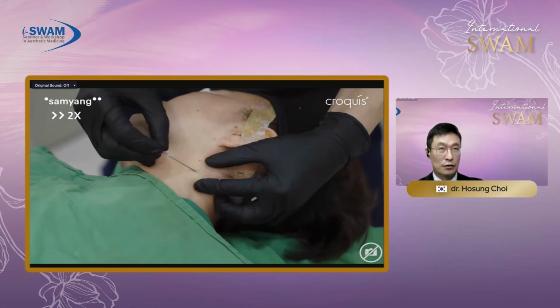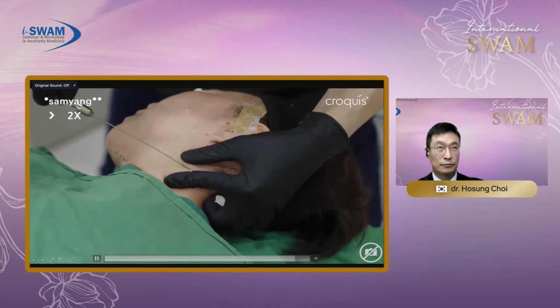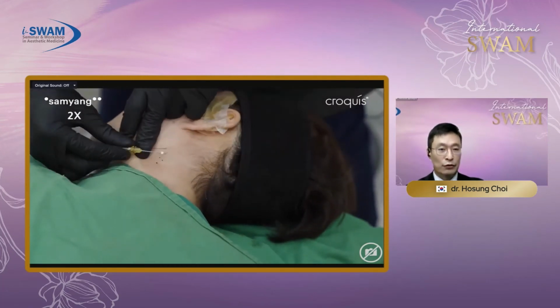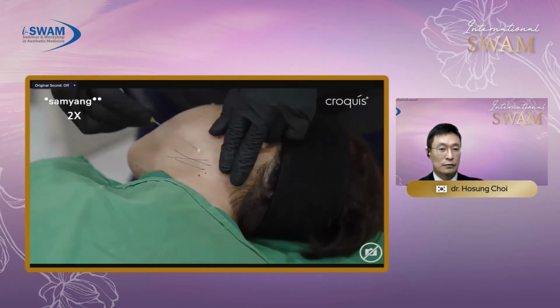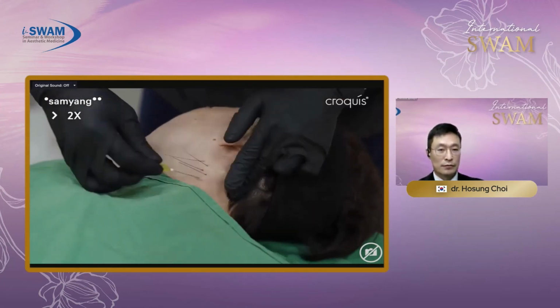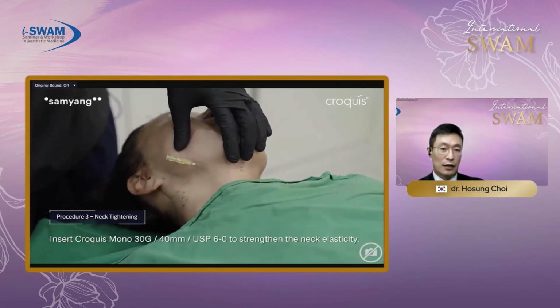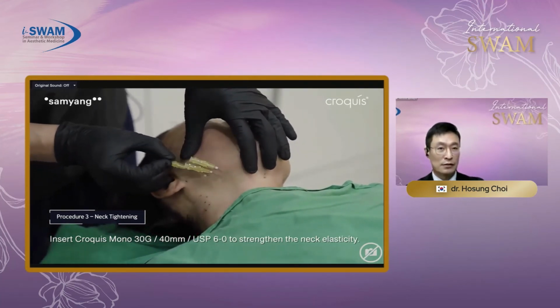Same procedure. Usually I infuse only 3 to 5 ml of tumescent because there's not enough space to infuse tumescent, and since I'm using very short PDO threads. Okay, now I'm inserting about 20 to 30 monofilament PDO threads.